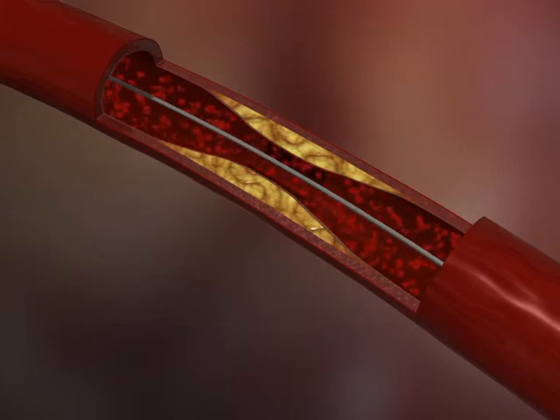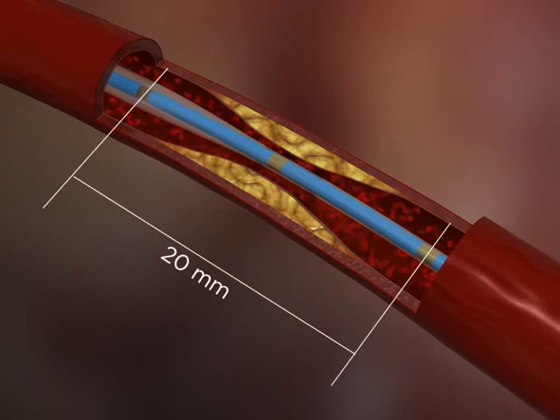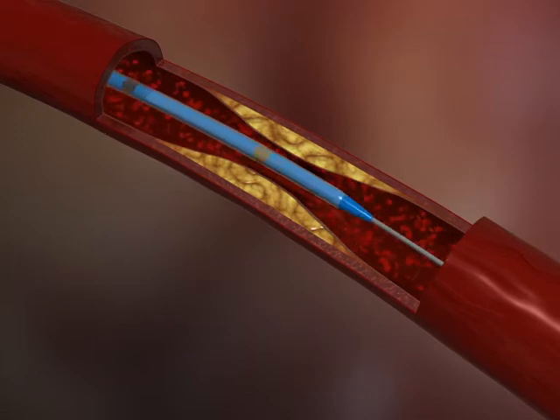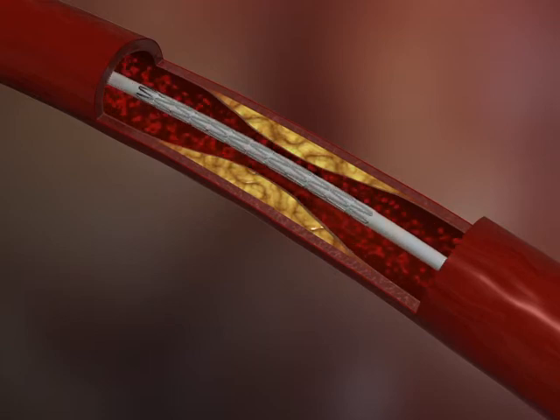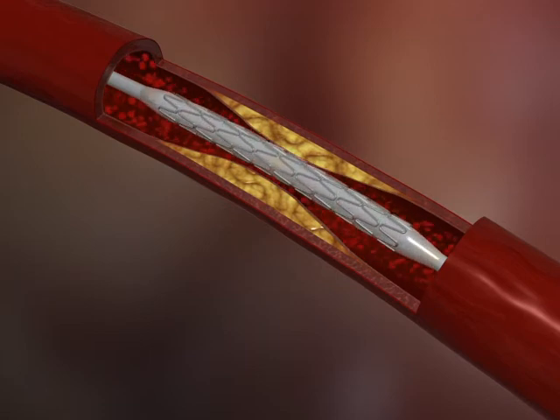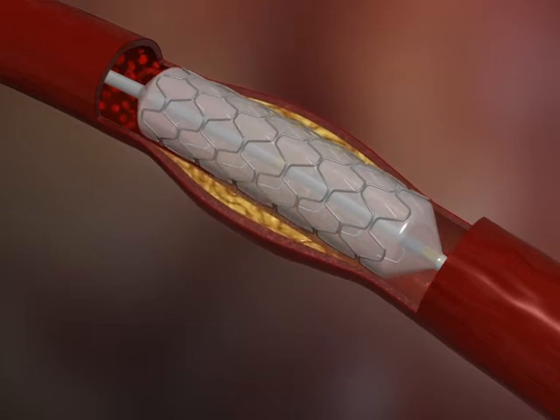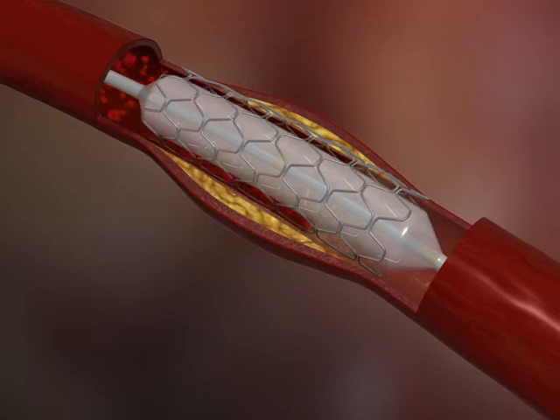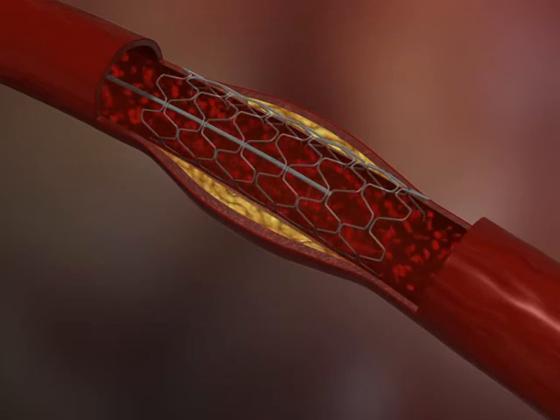The size of the stent to be implanted can be determined thanks to the catheter's radiopaque markers and viewing of the vessel. The preparation of the artery with the Amicath allows direct stenting to be performed without predilation with a balloon catheter and the risk of distal embolism. It also makes it possible to determine the need for thrombus aspiration prior to implanting the stent. The total duration of the procedure is very short. In the absence of a thrombectomy, it takes no longer than 5 minutes.